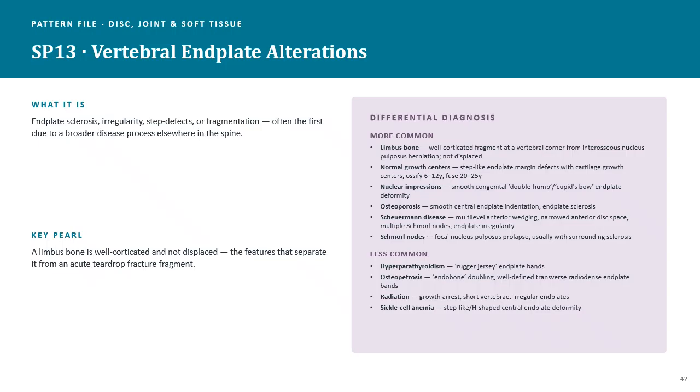With that, they want to start paying attention to what kind of change they are seeing. Is there some sort of defect or indentation, or is part of the bone becoming separated? Those two appearances can lead the doctor to what the possible condition is for the patient.